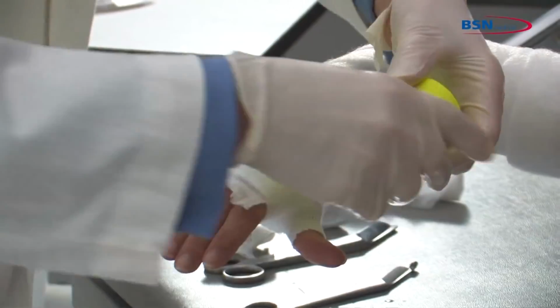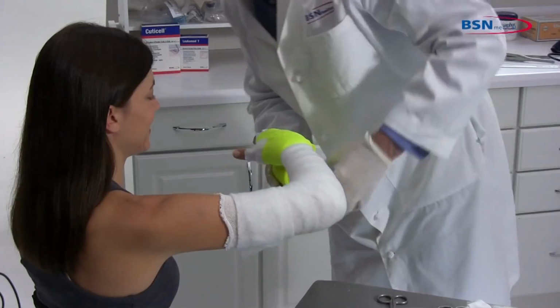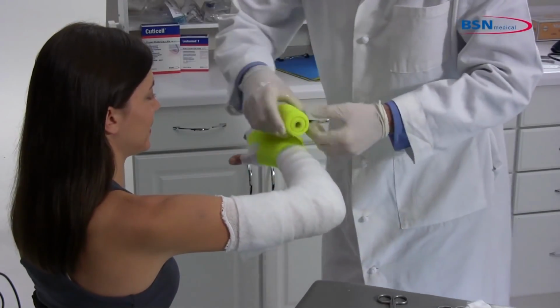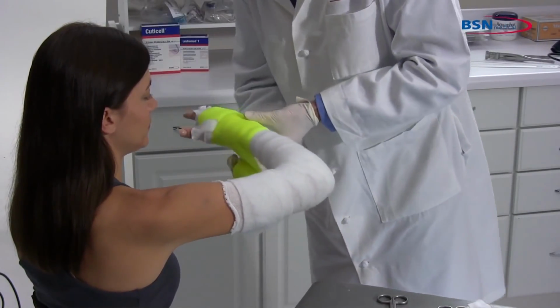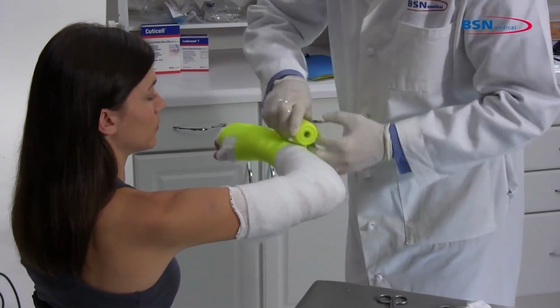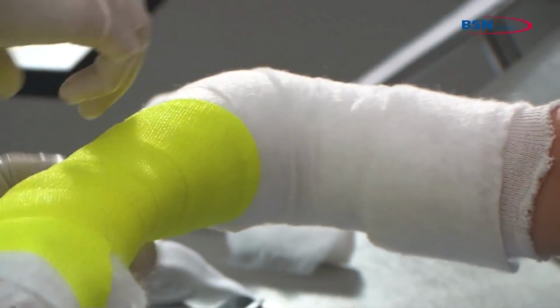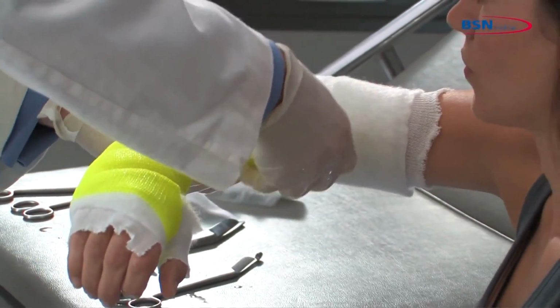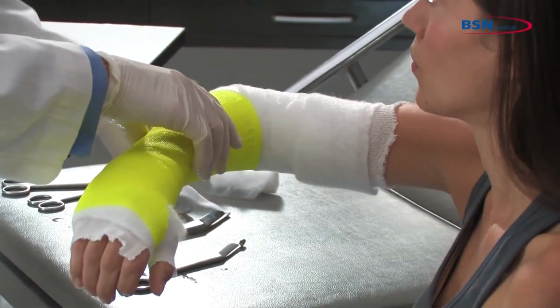Start wrapping the cast at the wrist and go through the web space. Then go around the hand and continue with 50% overlap toward the elbow. Avoid placing the edge of the cast tape in the antecubital fossa and continue wrapping toward the upper arm with 50% overlap.